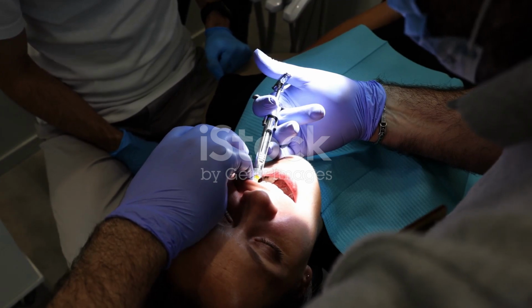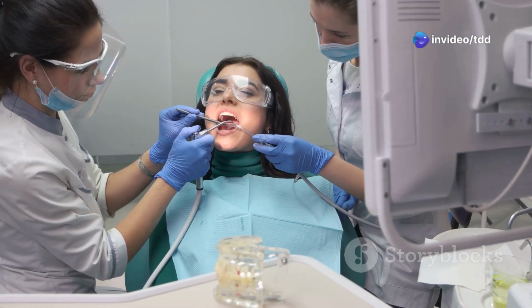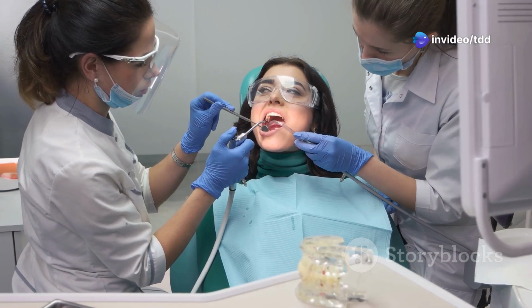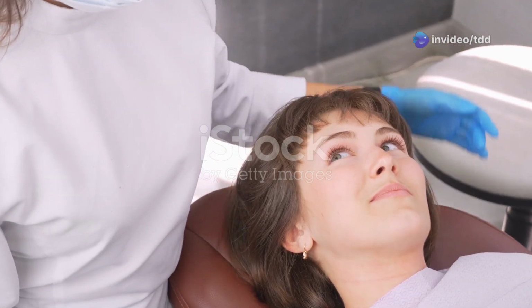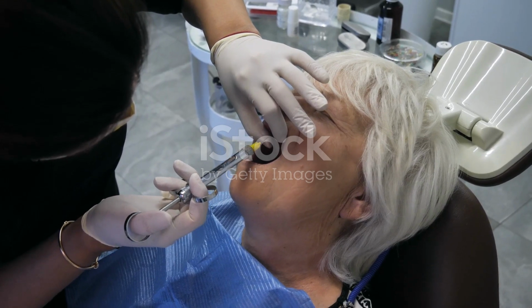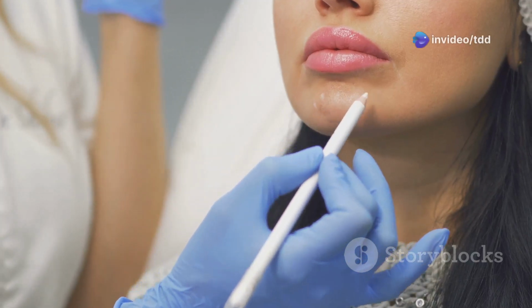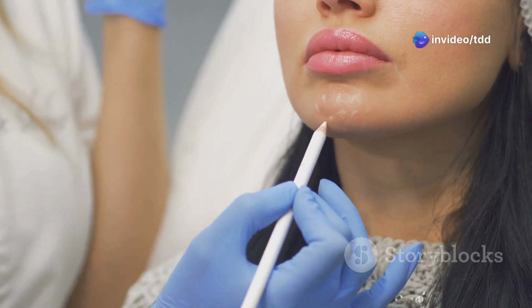For more complex cases, we have advanced techniques like the Gow-Gates block and the Akinosi-Vazirani technique. A. Gow-Gates block. Purpose: anesthetizes the entire mandibular division, V3. Where to inject: near the lateral side of the condylar neck. Landmark: align the needle with the tragus of the ear and the corner of the mouth.